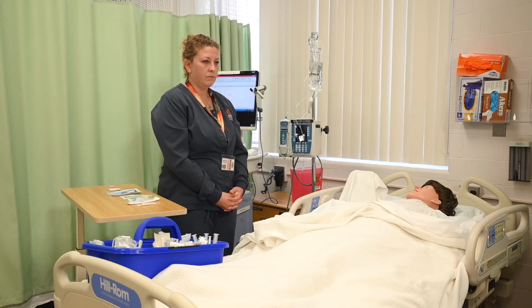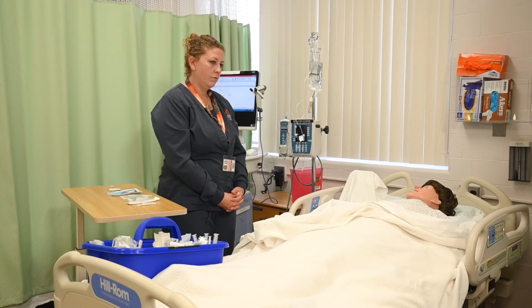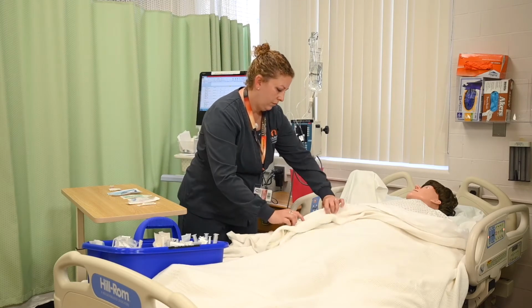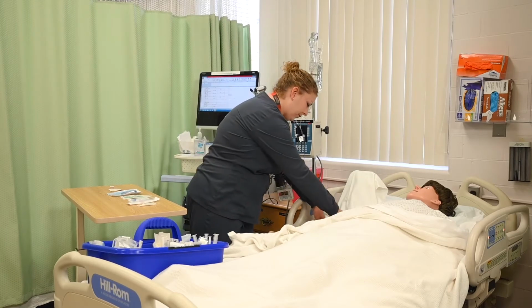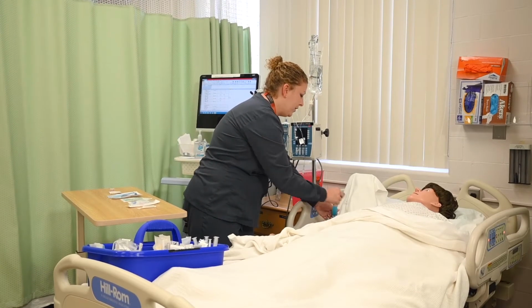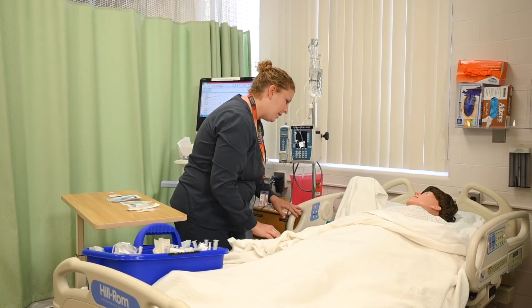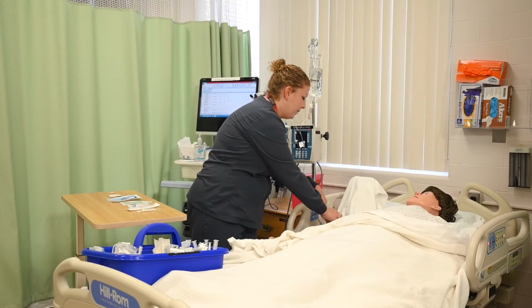Visually select a vein and use tourniquet if necessary. Use vein visualizing technology if available. I'm going to apply this tourniquet. Good, I see a vein that we'd like to use.